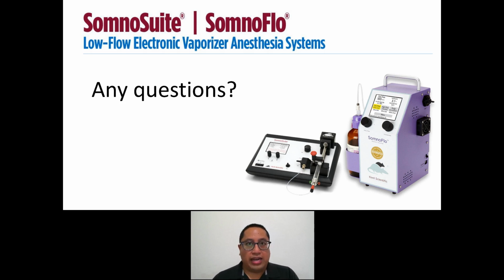I believe that as you perform longer procedures, your SpO2 levels will start dropping. And I believe that is a good time when a few PIs and researchers will introduce the compressed gas just to kind of support the SpO2 levels for those longer procedures. With smaller, shorter procedures, SpO2 levels, as far as I know, are not affected.